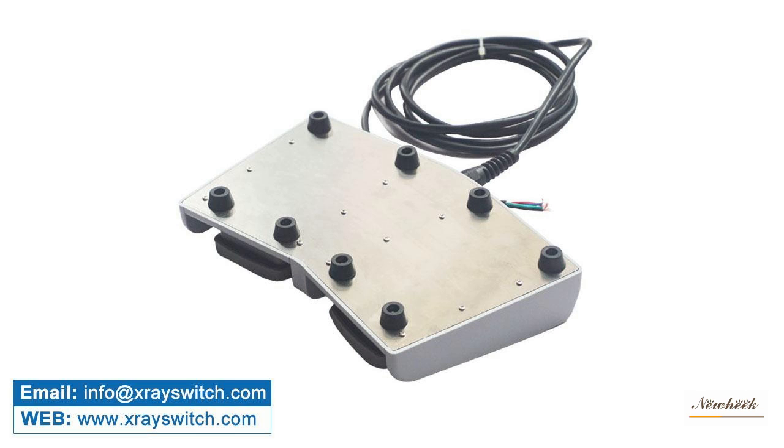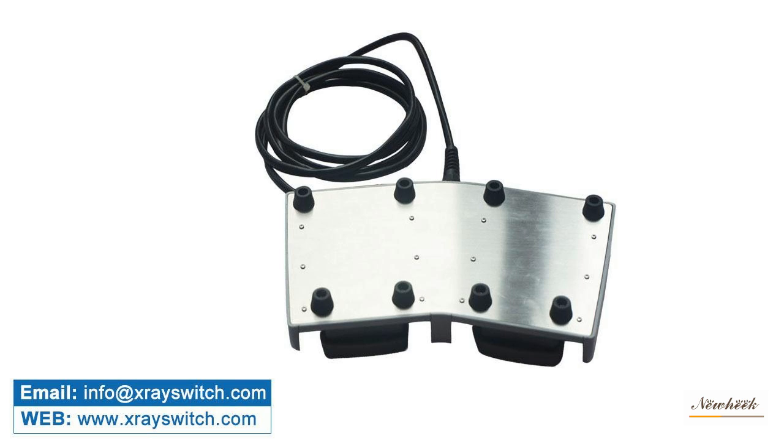The medical x-ray foot switch has precise control, rapid exposure, and low radiation dose, and can effectively protect the safety of medical staff and patients.